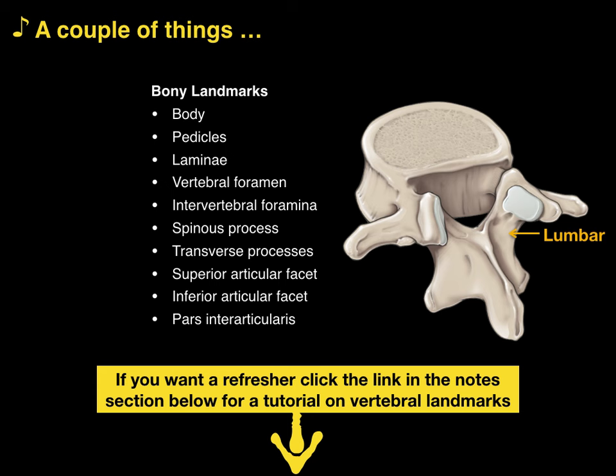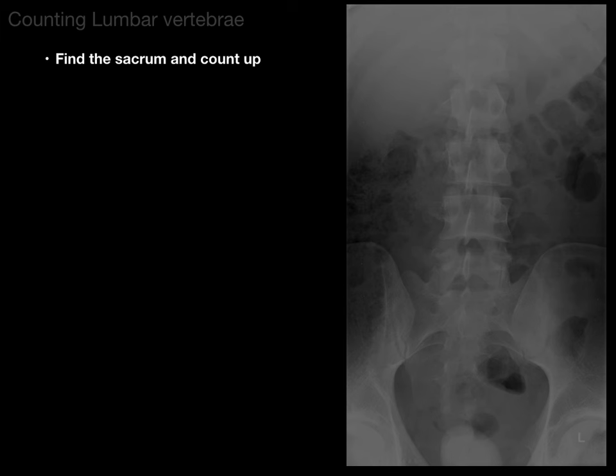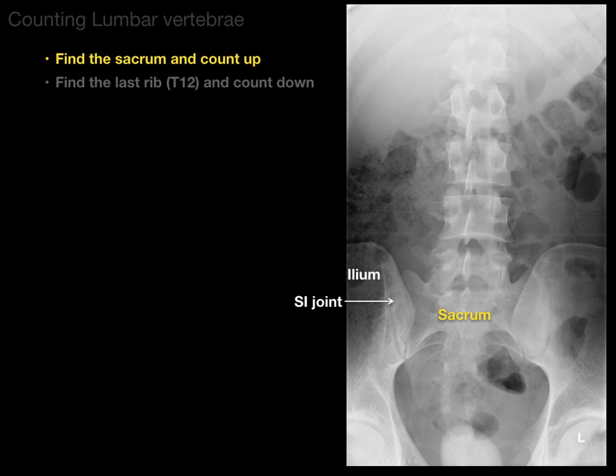So, counting lumbar vertebrae. You can find the sacrum and count up, or you can find the last rib which shows the T12 vertebra and count down. Let's do first: find the sacrum and count up. There's our sacrum, there's the ilium, and there's the sacroiliac joint in between. If you find the sacrum, then you know where L5 is, and you find L5, you know L4, L3, L2, and L1 vertebrae.